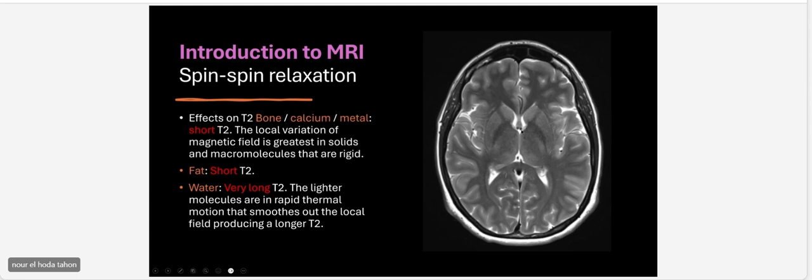It is abnormal when the vessels start to be thrombosed. There is something inside that catches a signal, like a thrombus or a dissection. A dissection also has a thrombus in the wall, and you can see maybe a bright signal in the wall, or it is occluded. So once you see it is not a signal void, this means an occluded vessel. It's abnormal. Once you see a flow void, that's good.